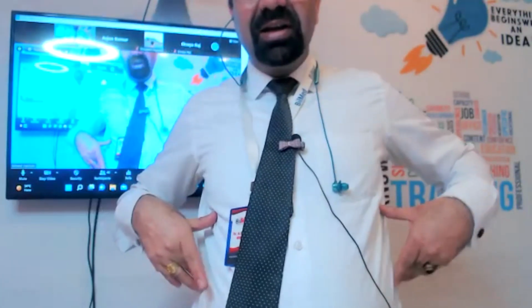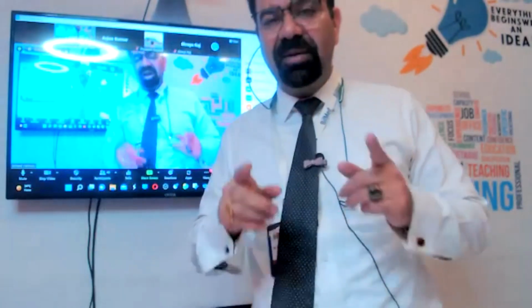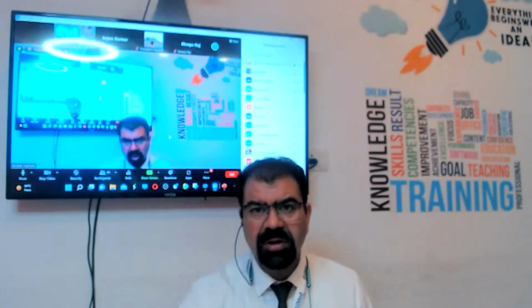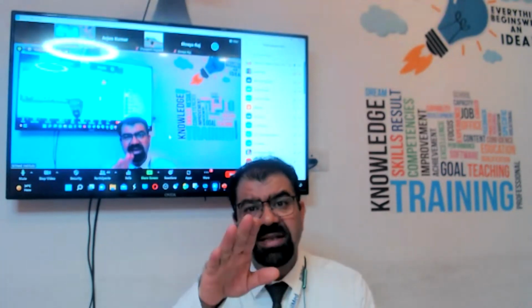That is not the transverse section, and that is not a coronal section. That is a complete mid-sagittal section. I am repeating for the fourth time now: not only mid-sagittal section, a complete mid-sagittal section, because in sagittal sections we also have parasagittal sections. But the ductus venosus will be seen in a complete mid-sagittal section.